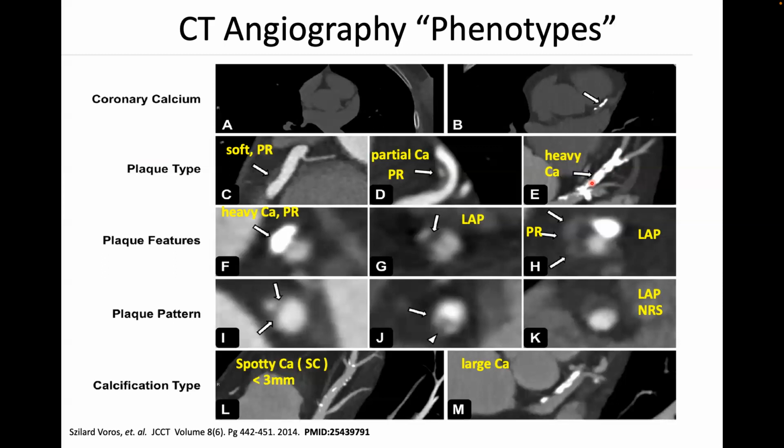This is obviously most troubling for people who are above, say, 65 years old, because you accumulate calcium in your vessels as you get older. So if you have a patient who's like 77 and you're going to do a coronary, the probability of getting a really good result from coronary CTA starts to go down if they're really old, because the probability they have a lot of calcium goes up.